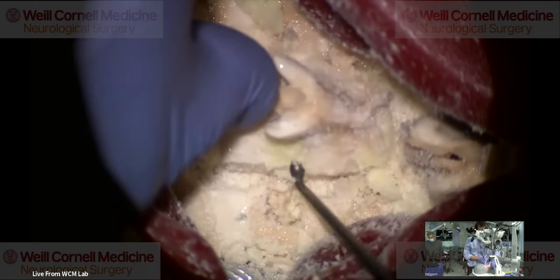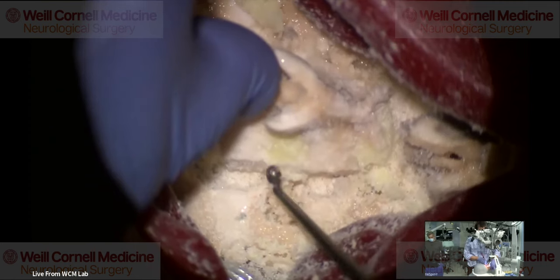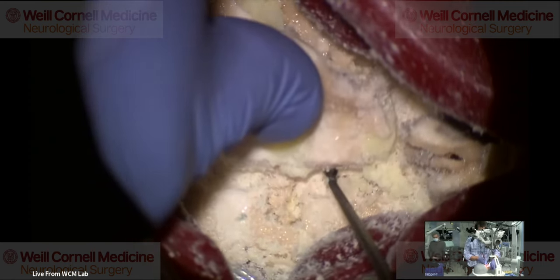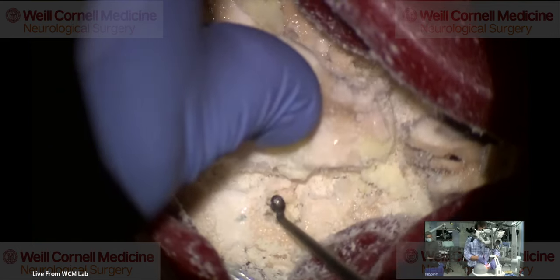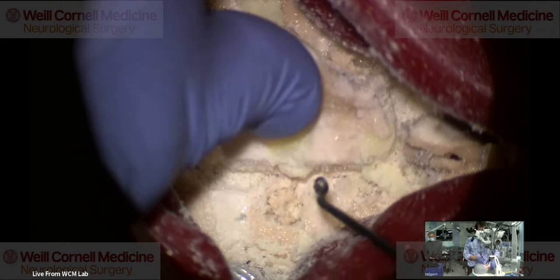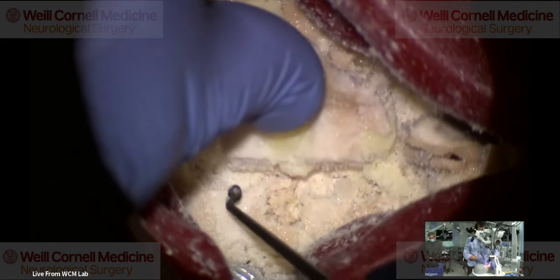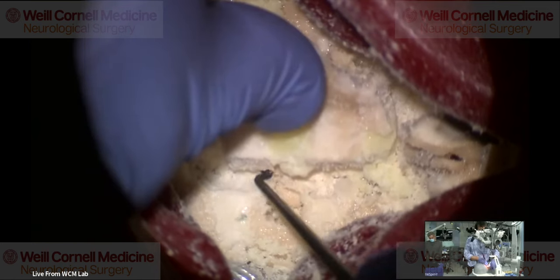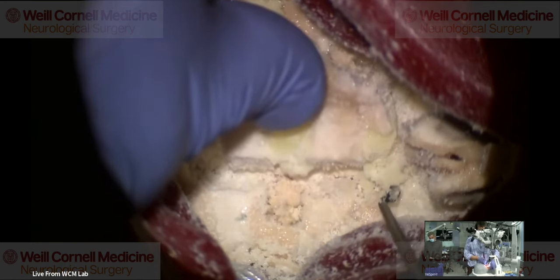This one, the ligamentum flavum is very stiff. It just kind of sticks together. In real life, you would separate it, lift one, and then lift the other. You take the ligament in the trough, or you make the full trough. You take that ligament out? On this side, basically it's a longitudinal ligament, so you could just do that with a curette and it'll cut.